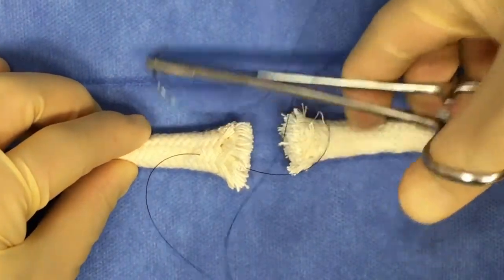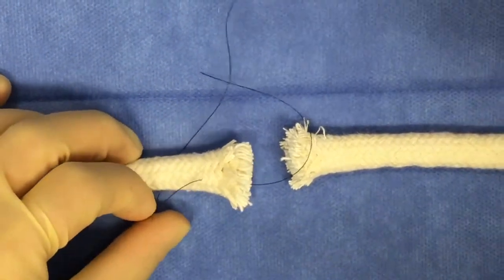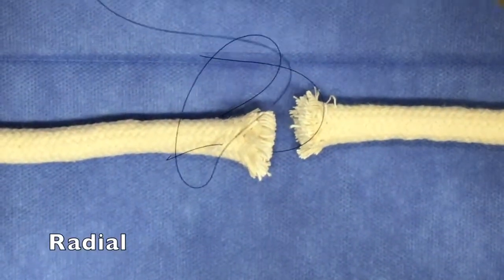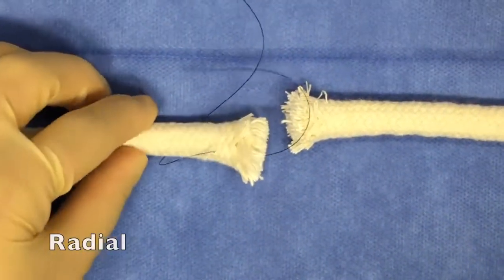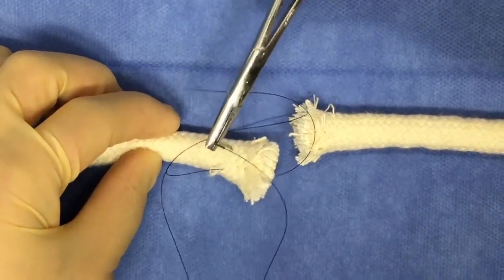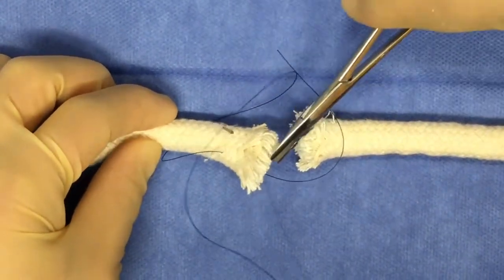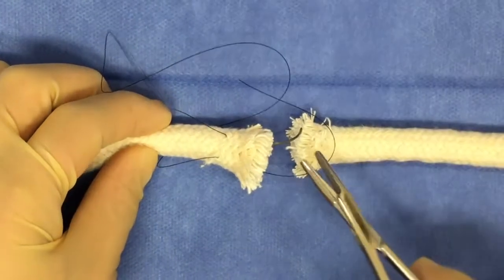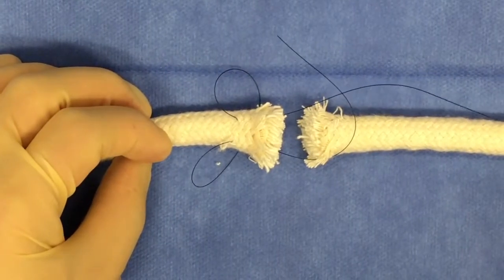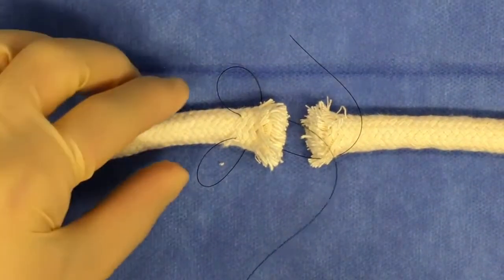You're then going to pass the suture behind the tendon, ventrally to the tendon, so that you can enter for your next throw, again, keeping the horizontal mattress suture pattern. You're now going to suture going through the dorsal aspect of the tendon. If you started on the radial side, you're now going to go more to the ulnar side and vice versa. And you're going to suture exiting out of the lacerated or cut end of the tendon. When done appropriately, you're going to start to develop this variation of a horizontal mattress suture pattern.